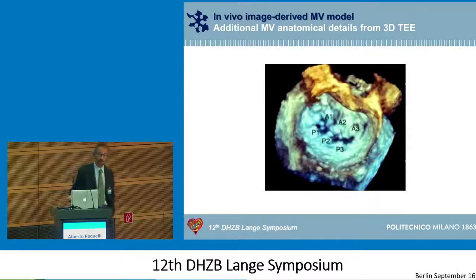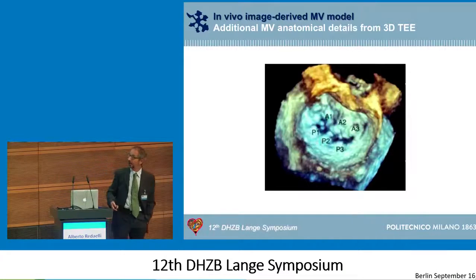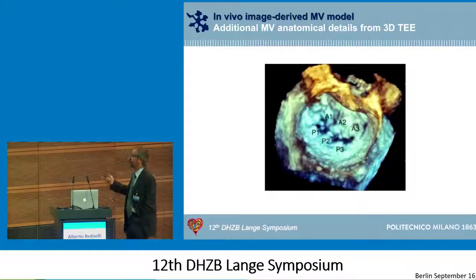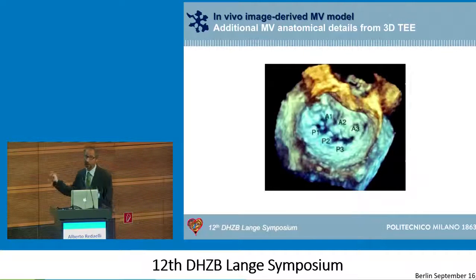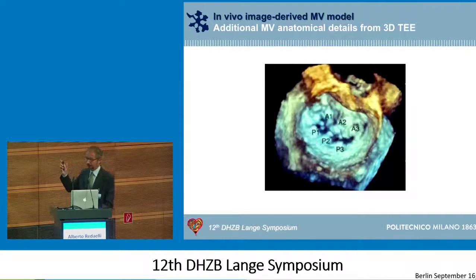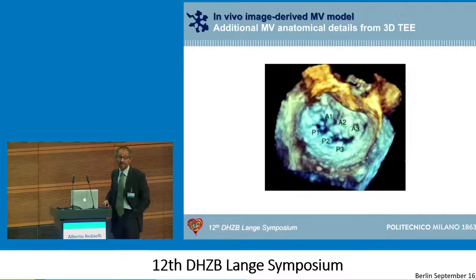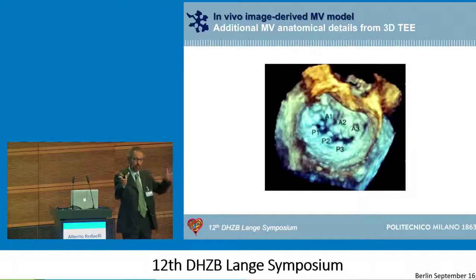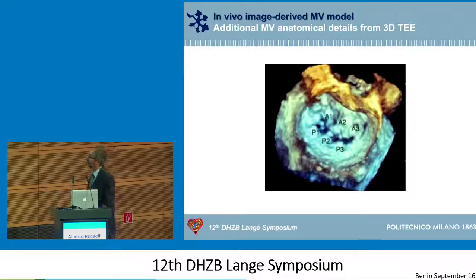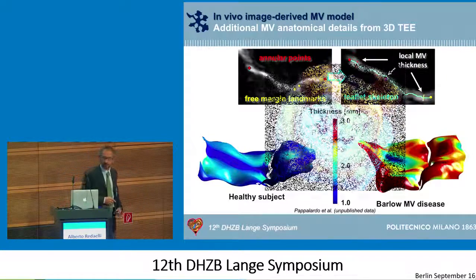The alternative is Eco3D. Eco3D is now almost the standard in clinics. It has some drawbacks. Well, concerning temporal resolution, it is quite close to MR imaging. Concerning spatial resolution, it could be even better, but the noise to signal ratio is still high. Sometimes we can't get the whole ventricle, so we miss, for instance, the papillary muscles if we want to look at the valve. But it also has some fantastic features like this.